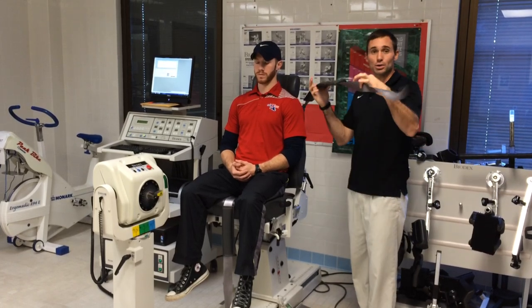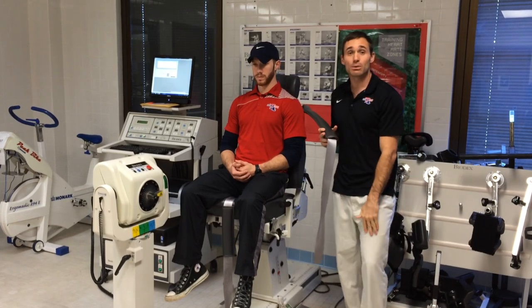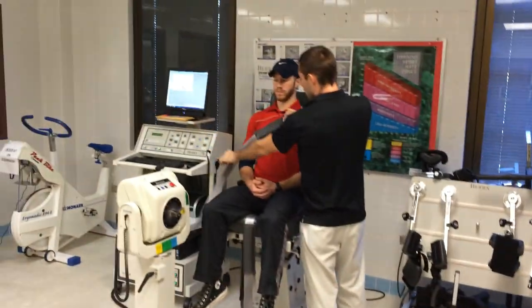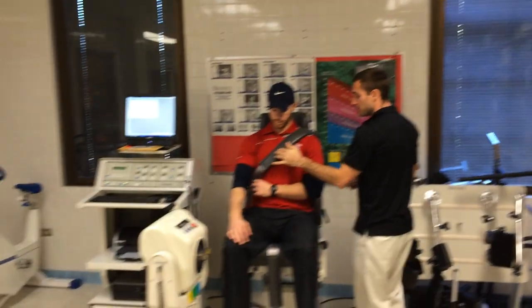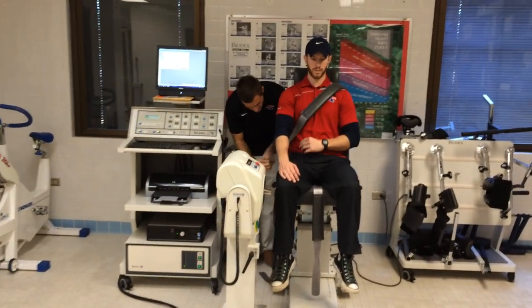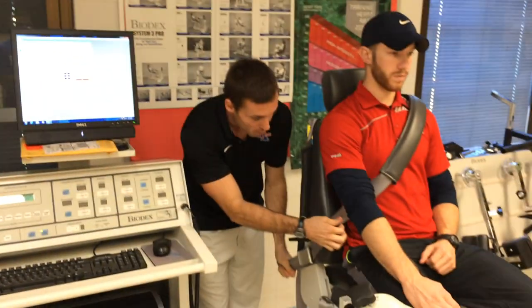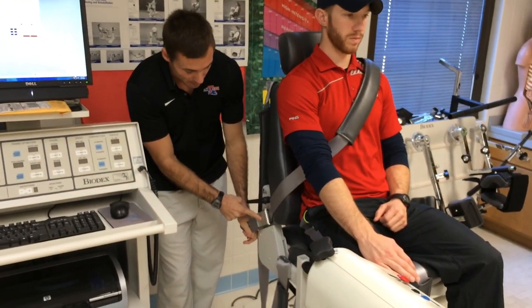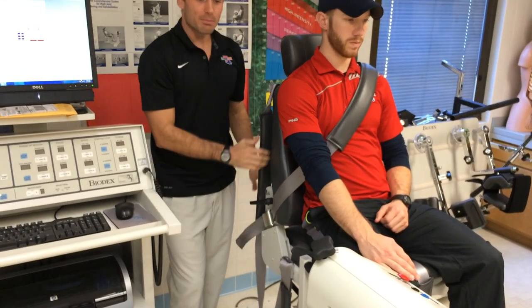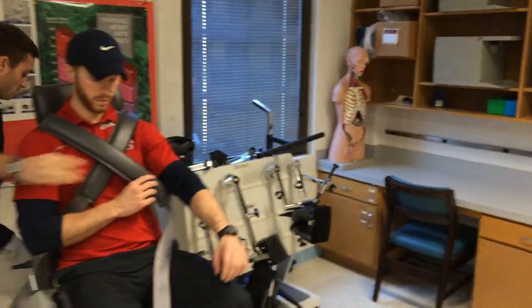So you see we're going to have shoulder straps, hip straps, a strap for the leg, and one for the ankle. The first thing we'll do is get his shoulder strapped in. So we're going to come across, arm on top, hold that for me there. There are a series of clasps where these straps go. These right here go to the back clasp right here. We want to pull pretty snug, but we don't want to debilitate. So we'll get this here. Again, we're going to come across with this one.